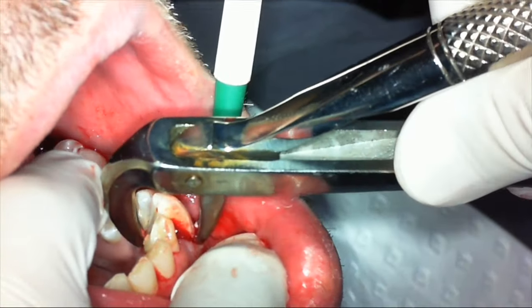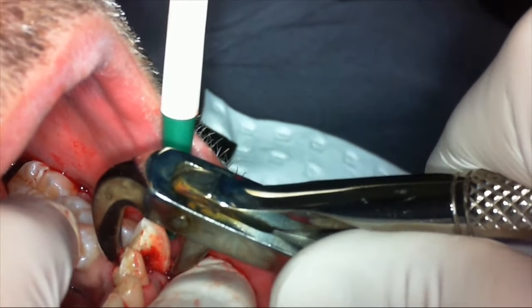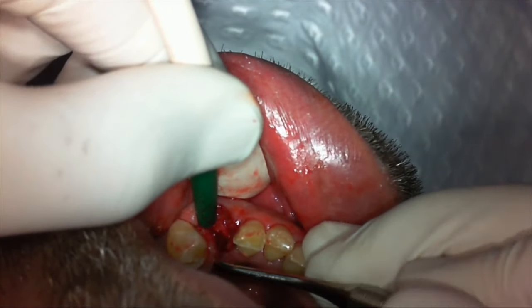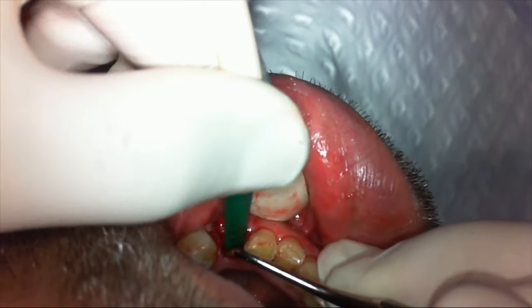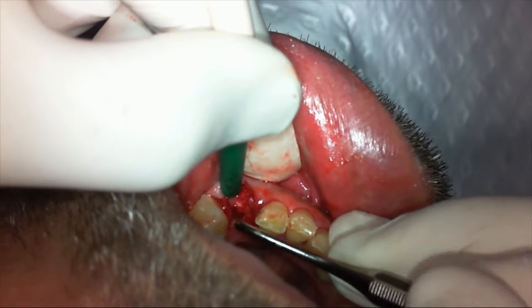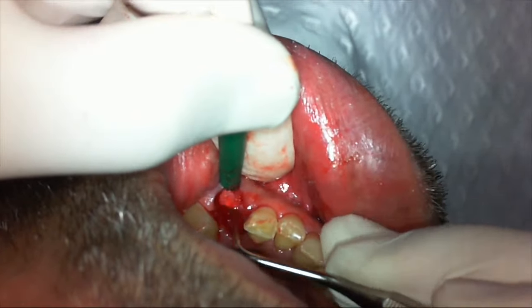So let's take out a lower broken canine. It has a horizontal fracture mid-root, so we're taking the coronal portion using forceps and now just removing some of the granulation tissue that was in between the two halves of the root.